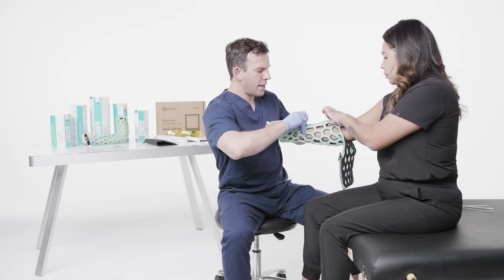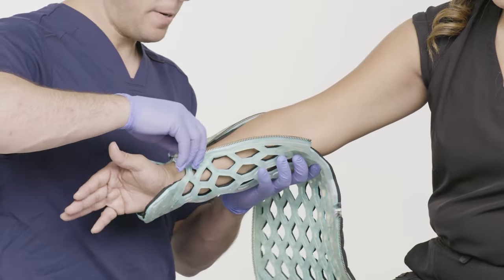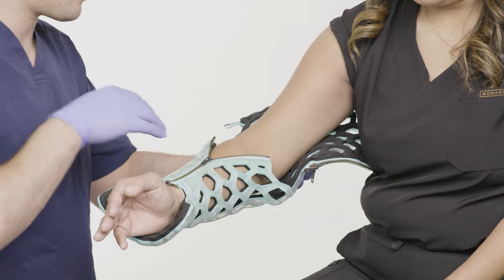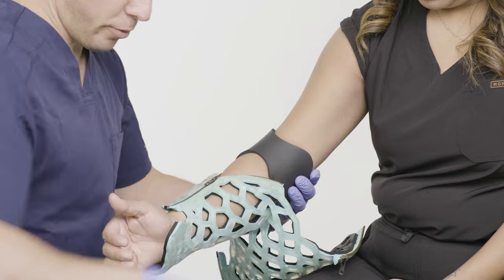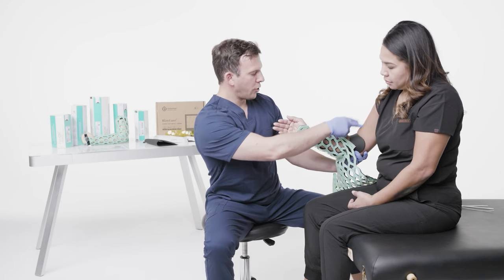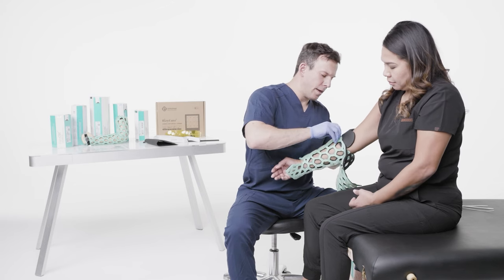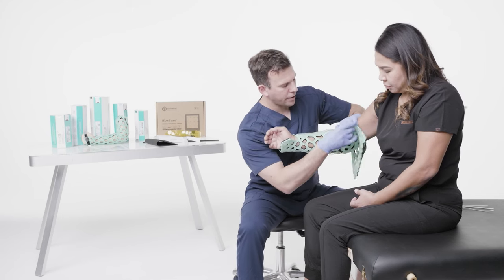You'll hear the zipper snap in. As you're zippering up the forearm, you don't need your patient's help anymore. Now that my zipper is on, I'm going to pull just a little bit of traction, just to get it away from the skin. Before I get to the cubital fossa, I want to protect it and all the sensitive structures there. I'm going to take a piece of the rubber and apply it right in that cubital fossa, making sure my patient is at a 90-degree angle — their thumb is up and should be in line with their humerus. They shouldn't be over-pronated or over-supinated.